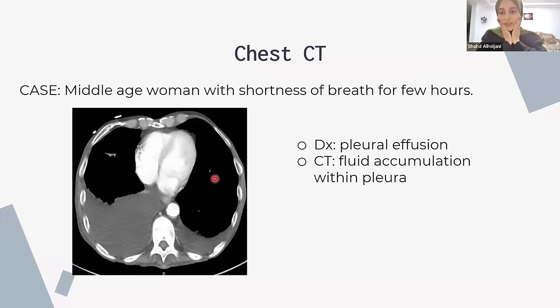The same thing in an X-ray, same thing in others. And you're looking at the patient from the leg side, not from the head side. So the patient is lying down. Imagine you're standing at the leg side and the directions are flipped. So here you have the right, here you have the left. Here you have more right pleural effusion than the left.